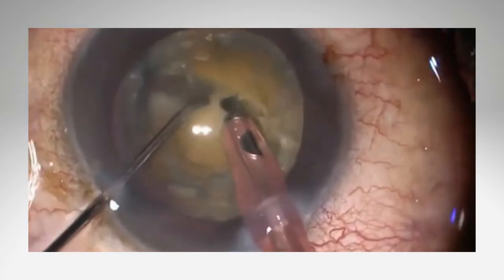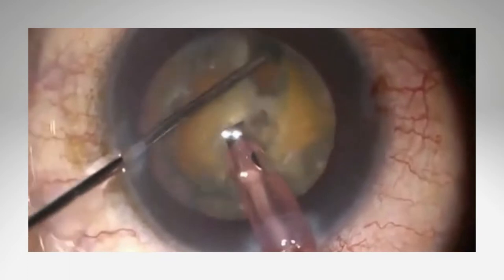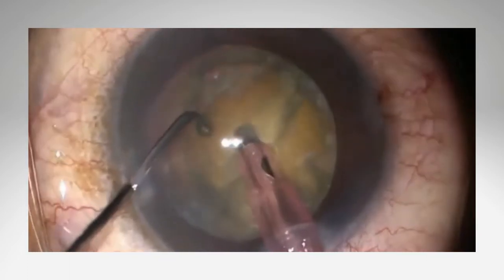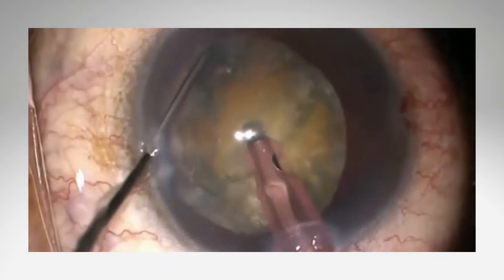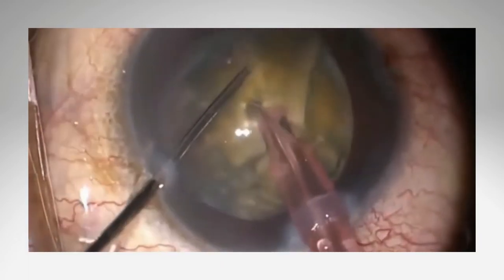The chopper plays an important role in phacoemulsification cataract surgery. Many variations of choppers have been developed, but they can be classified into two main categories. Depending on the technique for which they were developed, there are choppers with horizontal action and those with vertical action.